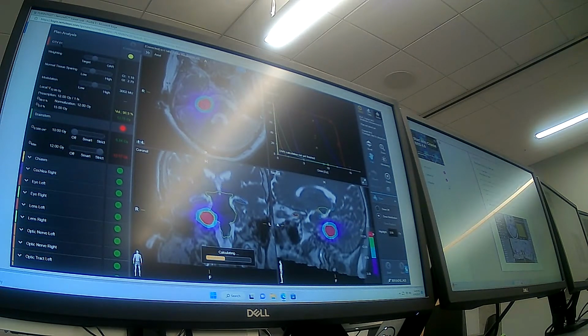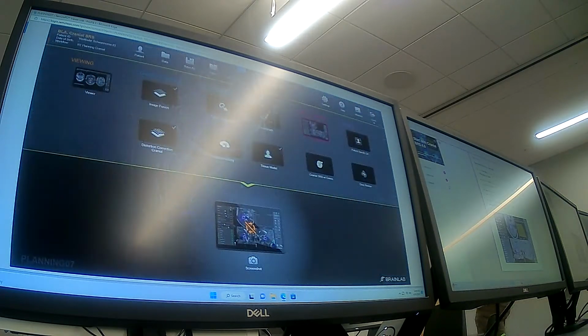Even if you got yellow, that's not bad. I mean, all it's saying is that it didn't fail. Didn't meet every criteria, but it's somewhere in there. Yeah. So, just 6% off, I call that a success. David, your 0.1% is not acceptable. 89.9%, okay, whatever.